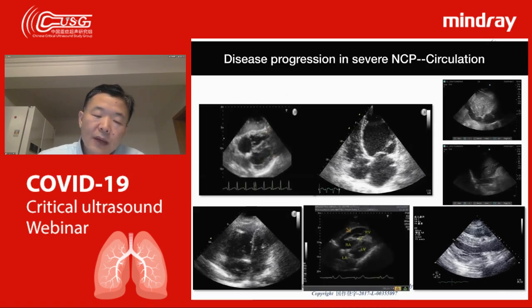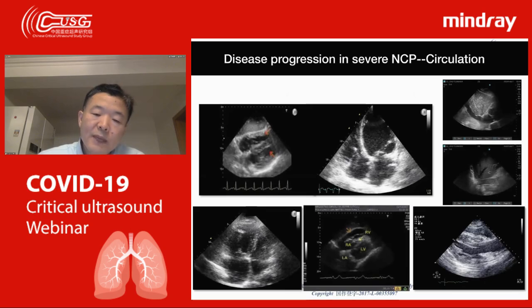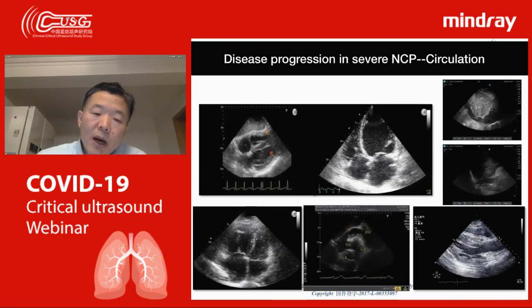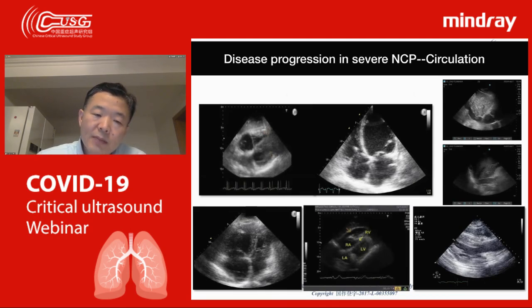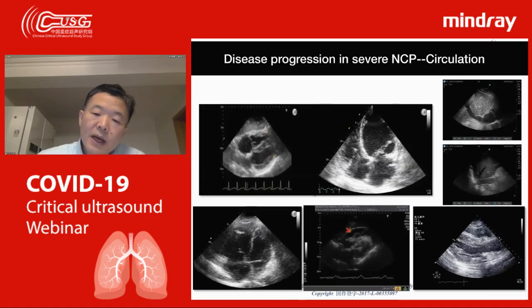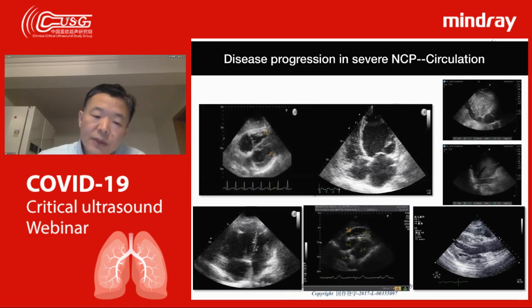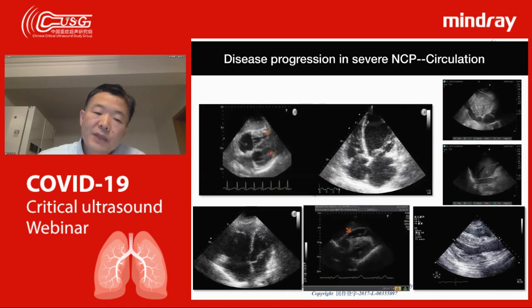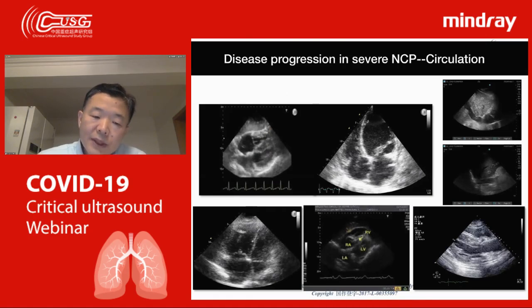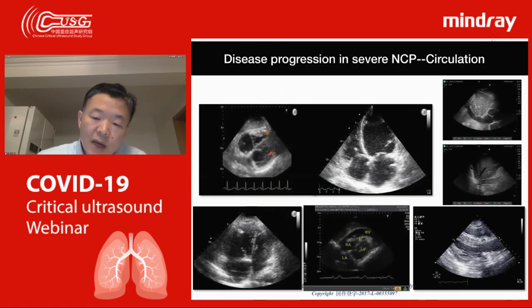And nowadays, more and more elderly patients stay with us. Especially in this disease, the older the patients, the higher the risk of severe condition. That means heart coexisting disease is more frequent. So you have to think about ultrasound. You have to monitor, or even use it to see your patient's heart function.